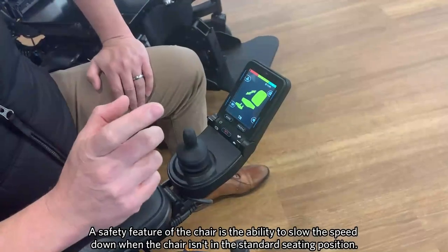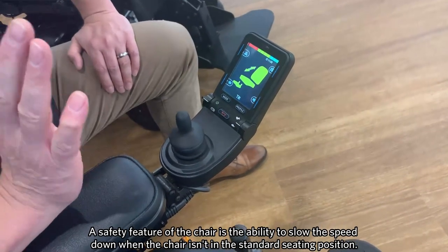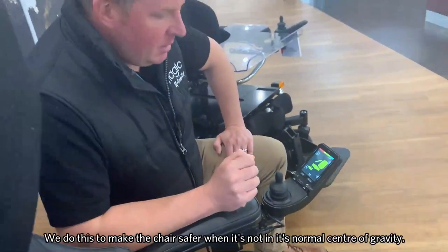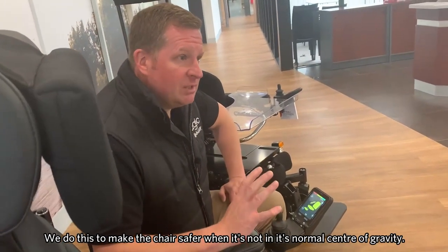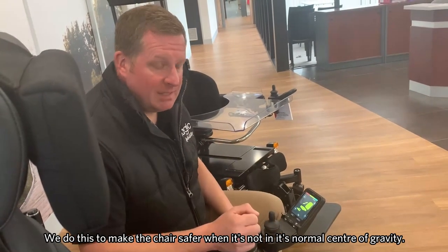One of the safety features of the chair is we have the ability to slow the chair down when we take it from its standard seated position. The reason we do this is because when moving — whether we're transferring from the chair or moving it away from its normal centre of gravity — we slow the chair down to make it safer.